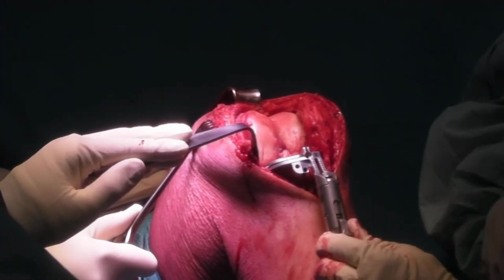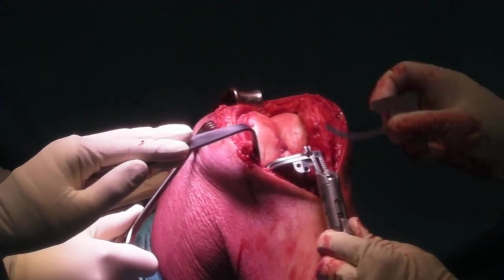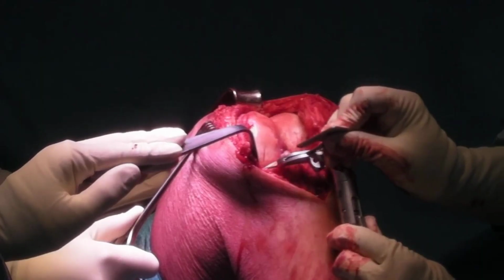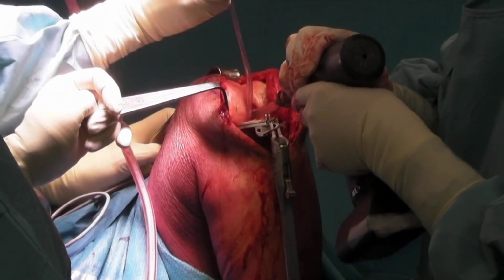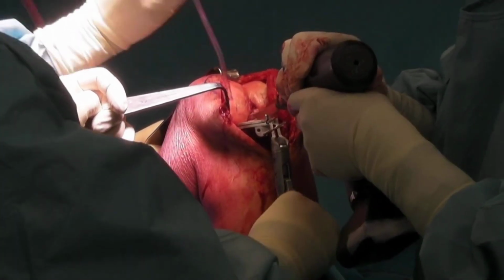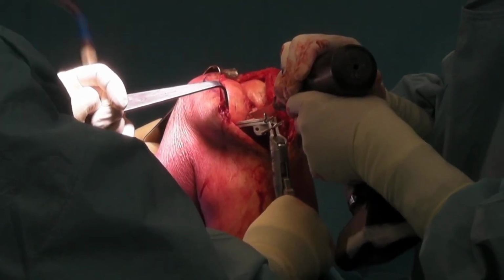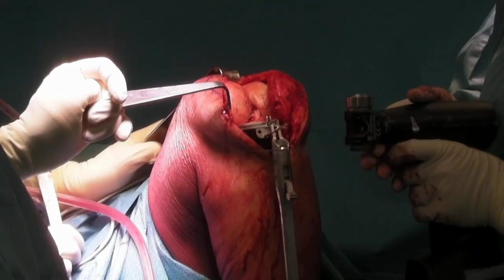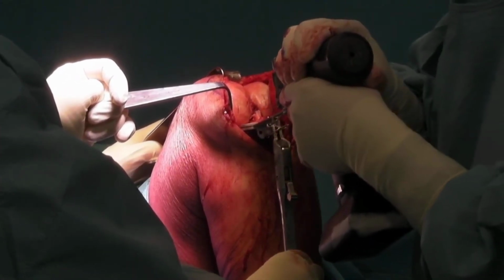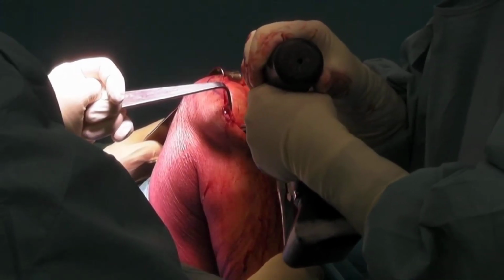After a few more steps, access to the joint is complete, allowing us to position the first guides for cutting the inner part of the tibia, which is done with two different types of motorized blades. The first is vertical, with a cut made alongside the cruciate ligaments, followed by a horizontal blade used to cut the inner part of the tibia.